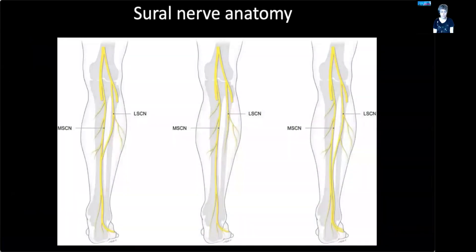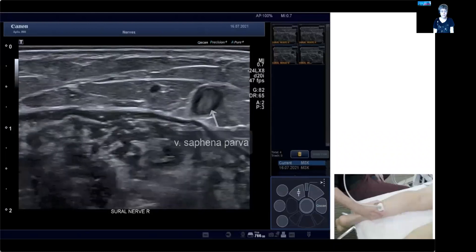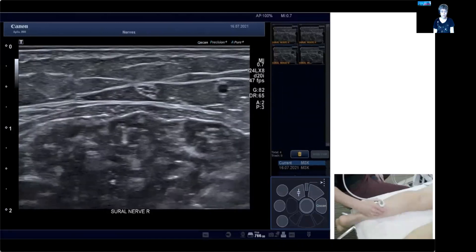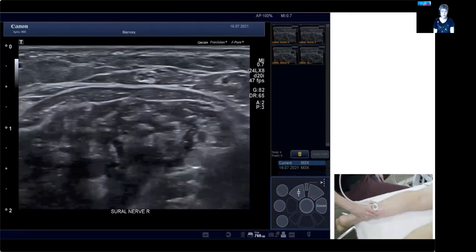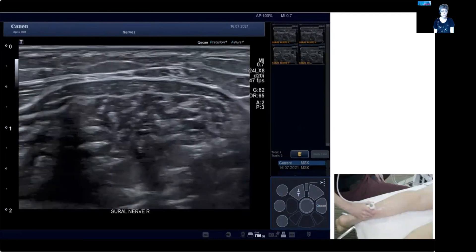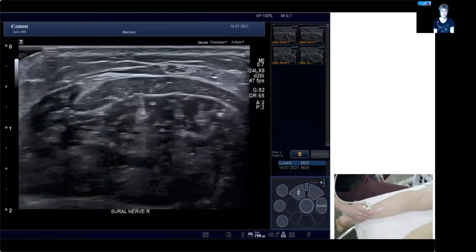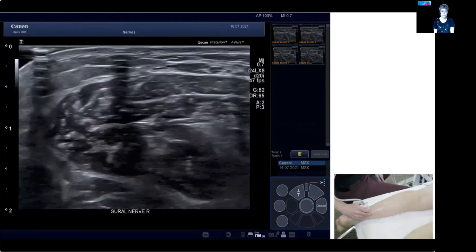Finally in this presentation, we're taking a look at the sural nerve. There are several anatomical variations, but usually it has a double origin — a lateral sural nerve and a medial sural nerve — one coming from the fibular nerve and the other from the tibial nerve at the level of the knee fold. It's easiest to pick up where you also pick it up with EMG conduction studies, at about 14 centimeters proximal to the ankle. You can see it here in the lower leg over the calf muscles, next to the small saphenous vein, just above the fascia in the deeper layer of the subcutaneous area. It has several fascicles here.